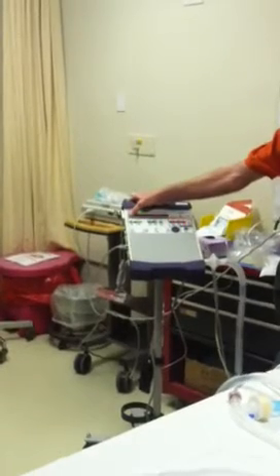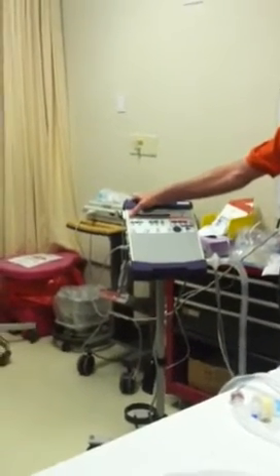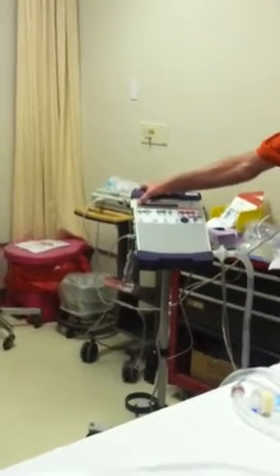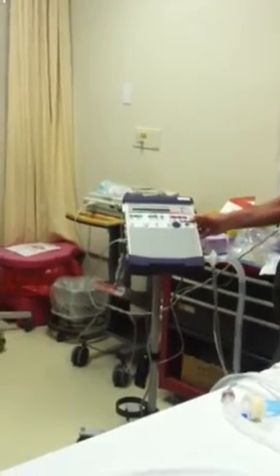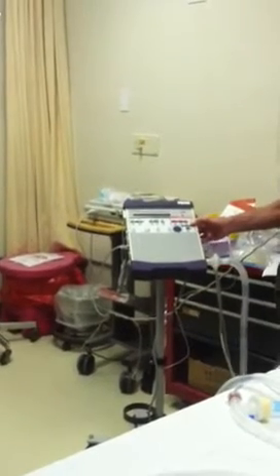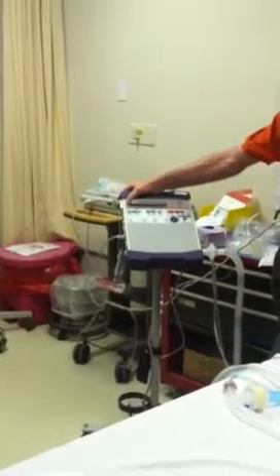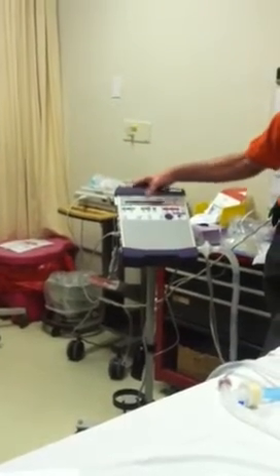Now, as a respiratory therapist, we have to do vent checks every 4 hours. And when we come in to do our vent checks, and you won't have to do this, this is where we get all our information right here.